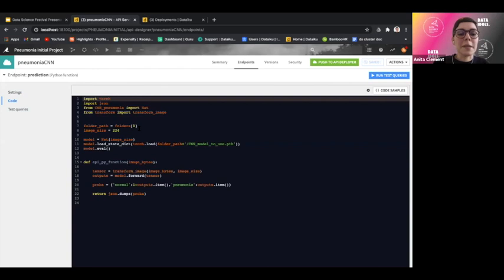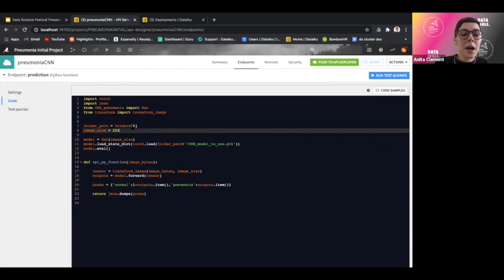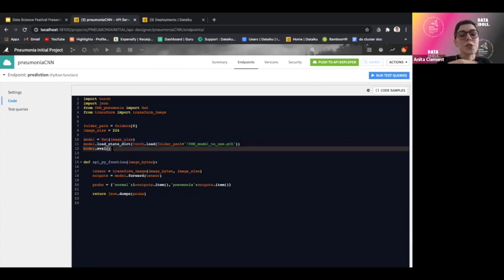So because it's embedded now, I can basically access it using that folder variable. So that's the first line of the code. Then I just specify the size of the image in general. Then I define the architecture again and load that model, because that's the way it works in PyTorch. You have to redefine the real architecture to then be able to load your saved model. And then I just switch to eval mode because I don't want to update any parameters. I'm just using that model to now do prediction.